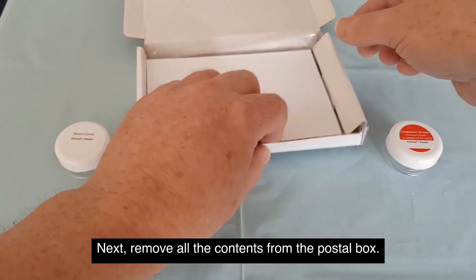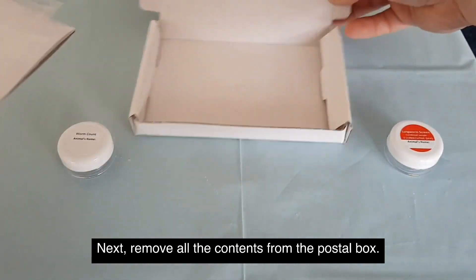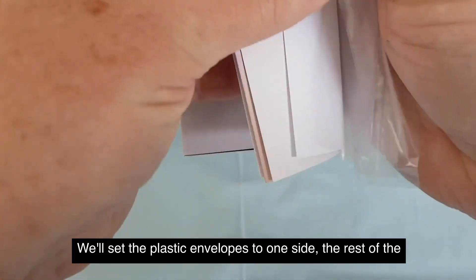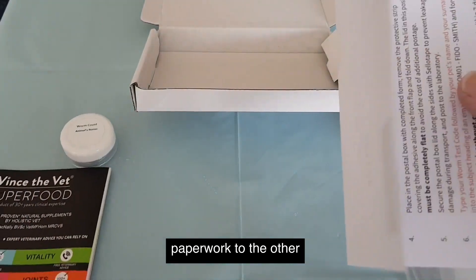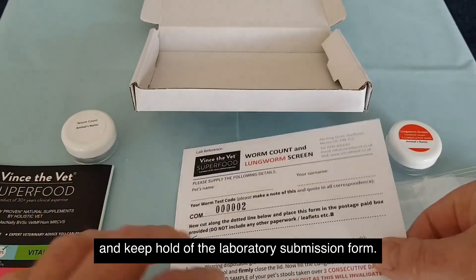Next, remove all the contents from the postal box. Set the plastic envelopes to one side, the rest of the paperwork to the other, and keep hold of the laboratory submission form.